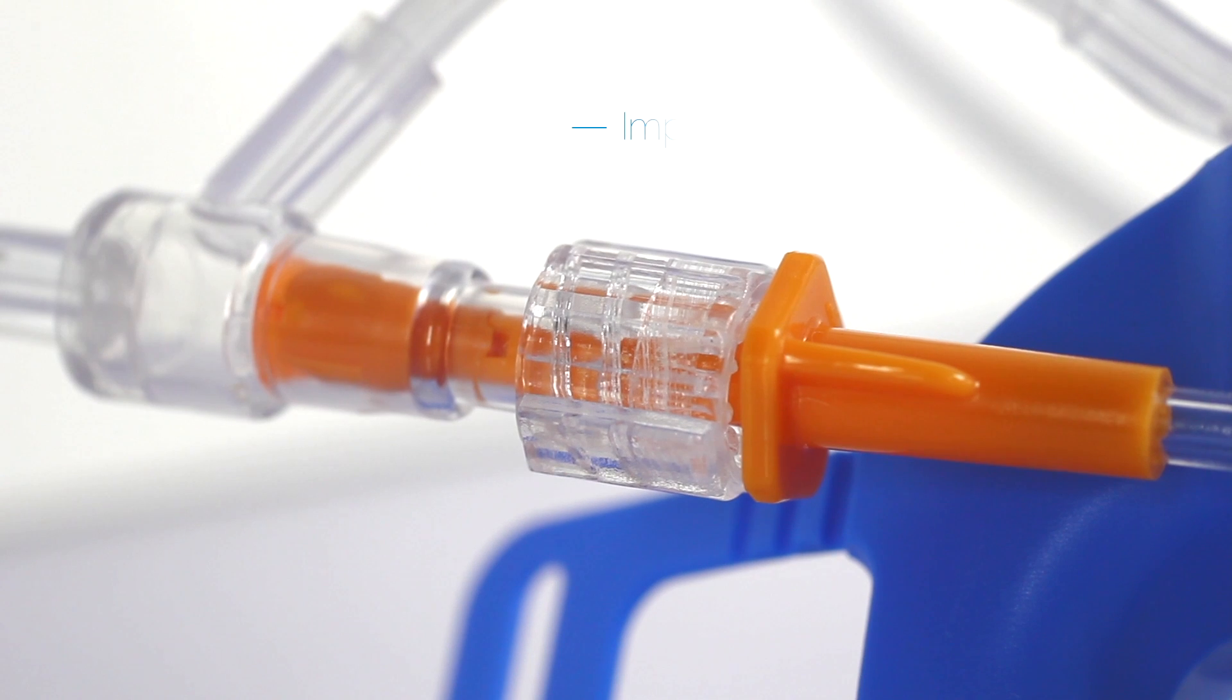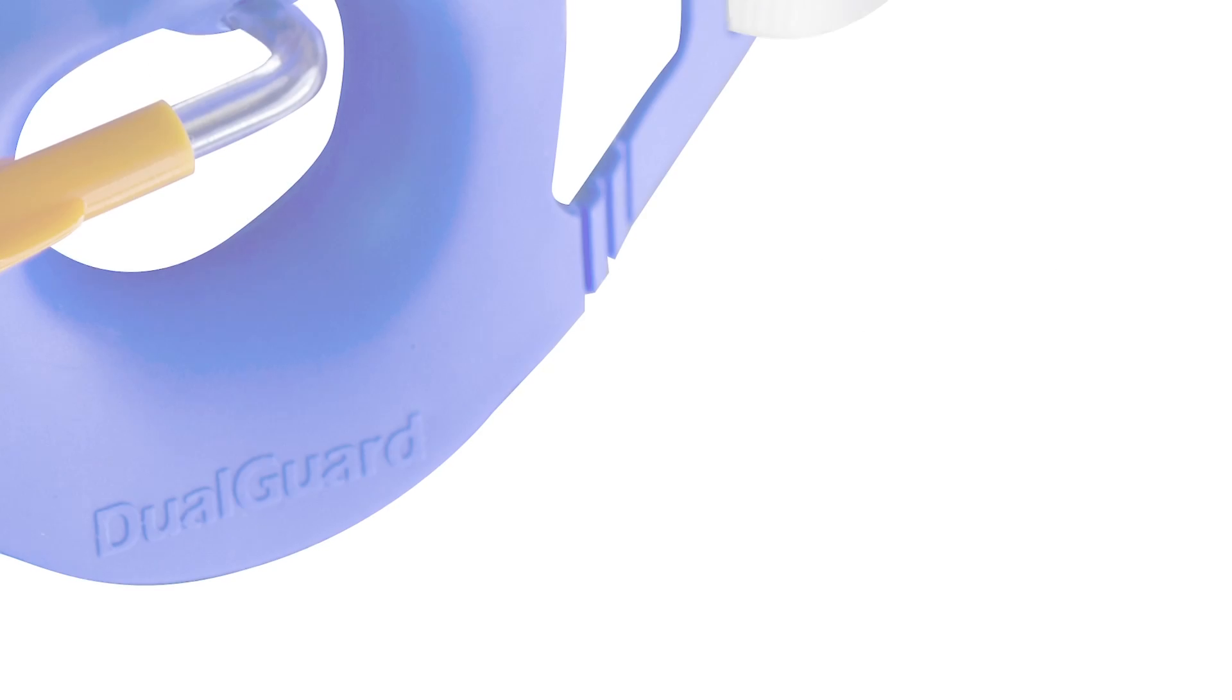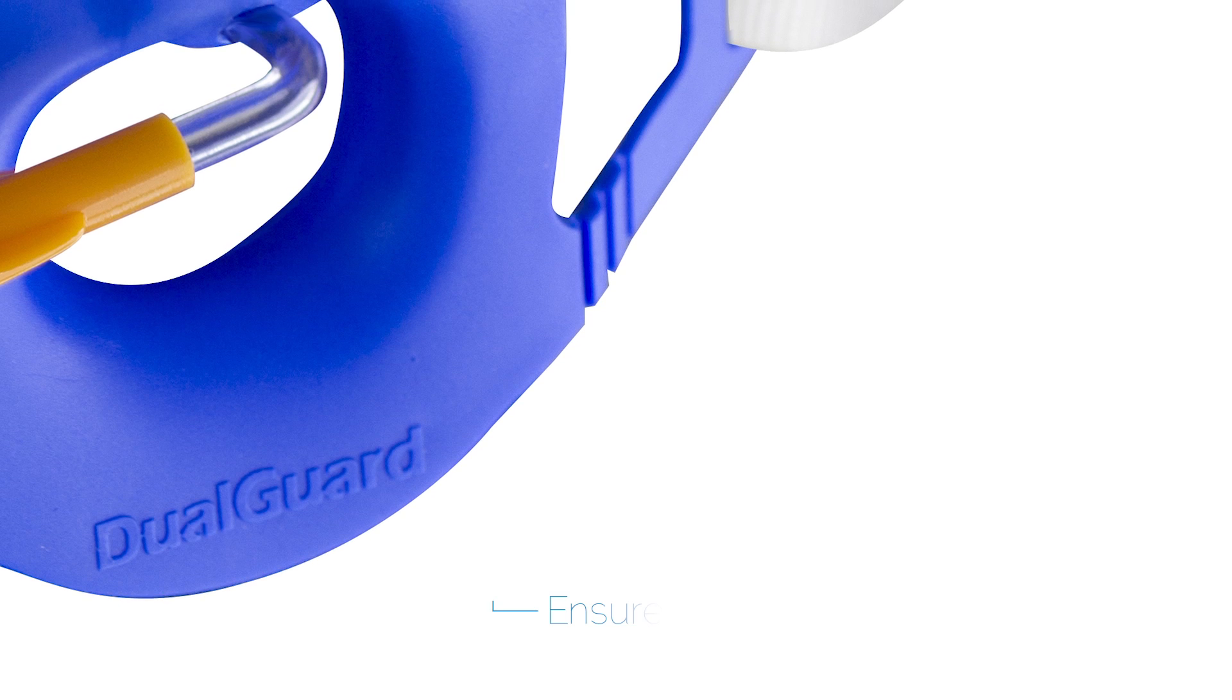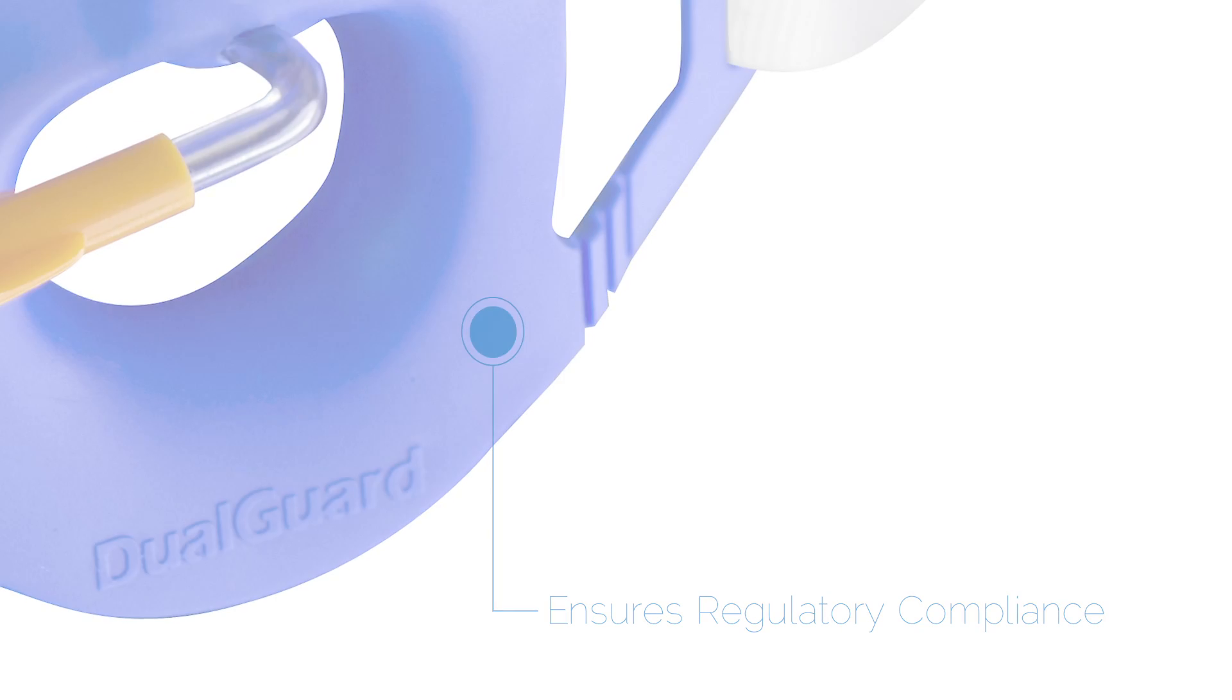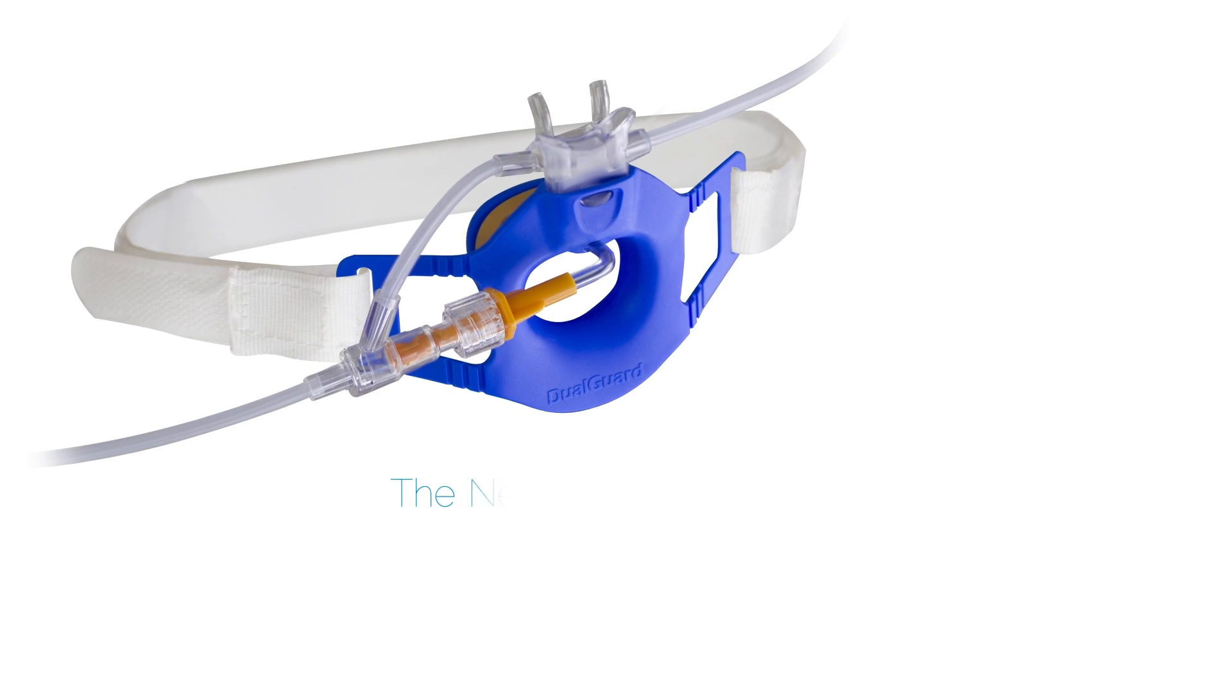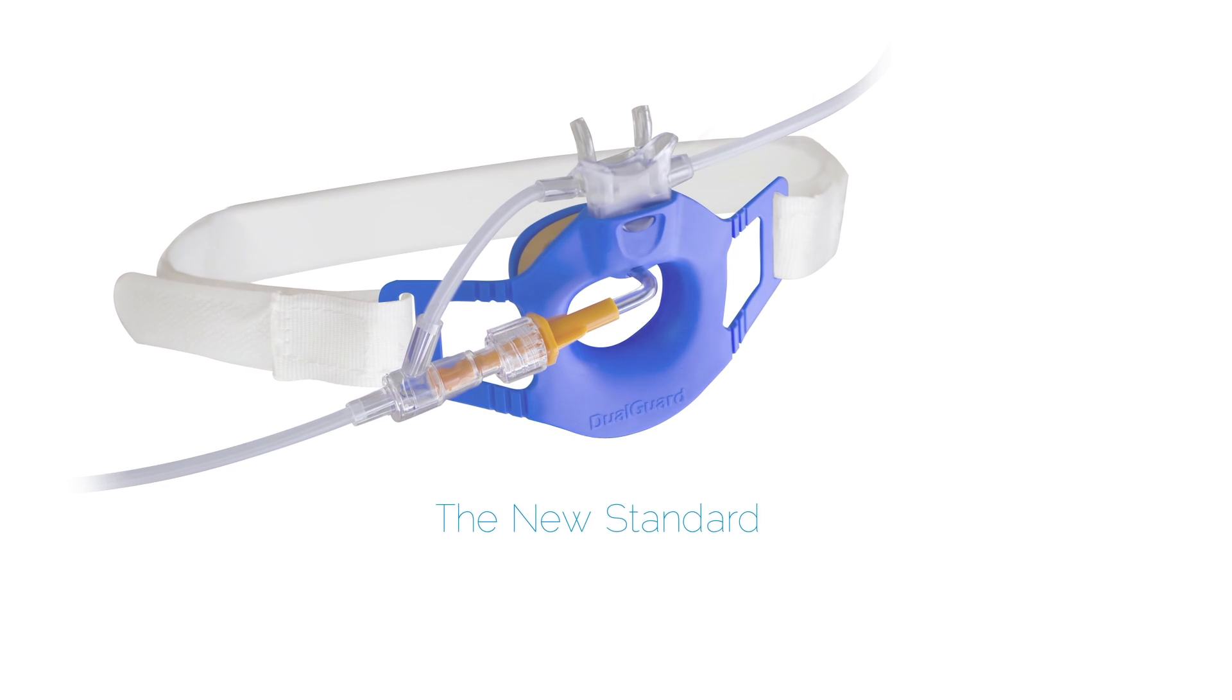Dual Guard's oral and nasal O2 delivery and CO2 monitoring improve patient safety and ensures regulatory compliance. Flexicare's innovative Dual Guard sets a new standard in endoscopic practices.